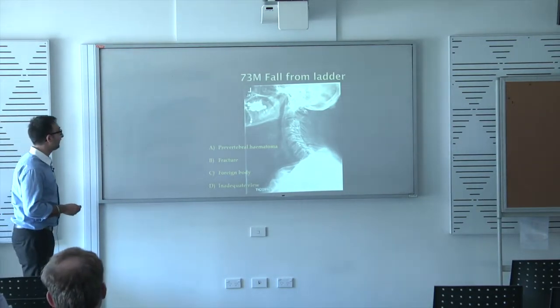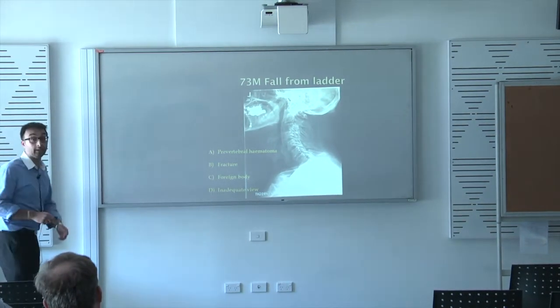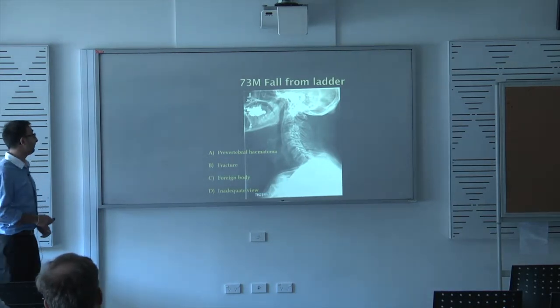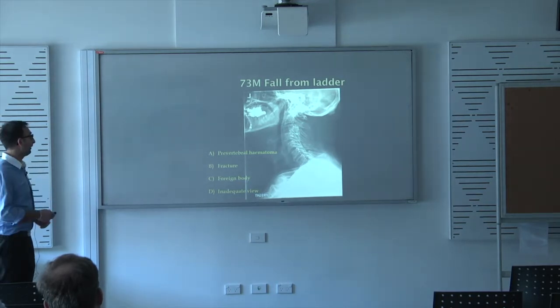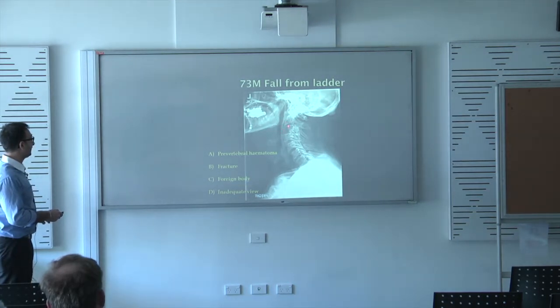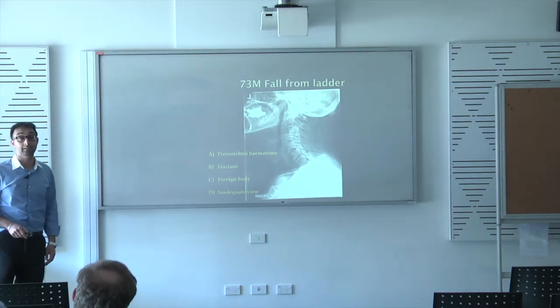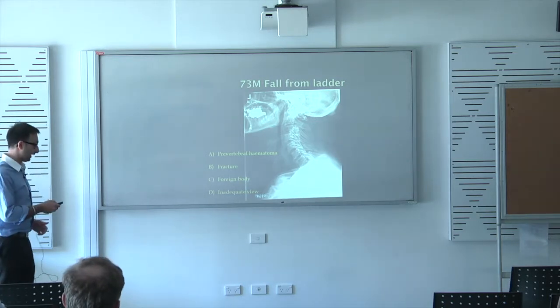Oh, yeah, I agree that you can't see it, but I guess if you windowed it, you can just get the bottom of it. But yeah, you ideally want to see C7 or T1 to clear the cervical spine, so we get an adequate view. It's not much better. But what this shows, and it's very difficult, is if you follow the anterior spinal line, it's a little bit funny at C2, C3 here. And then it's a bit harder to follow the posterior line. And the C2 vertebral body doesn't look normal. I know these are not diagnostic projections, but you've got to take my word for it.